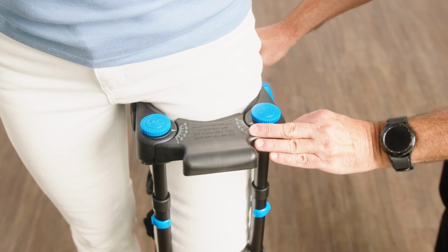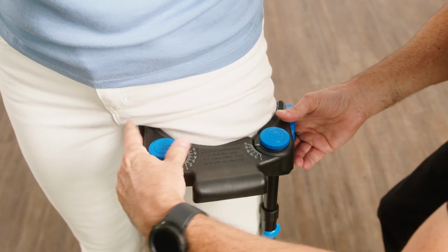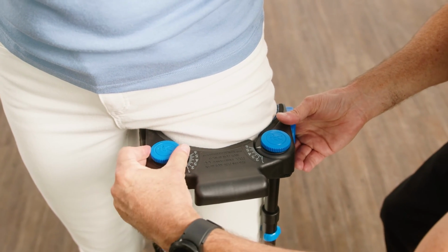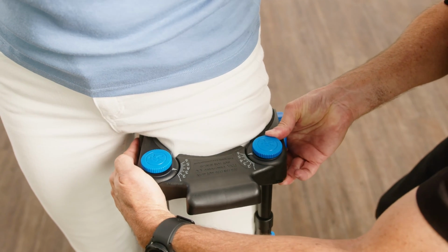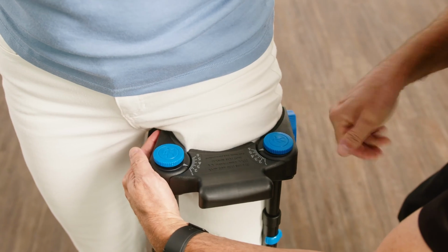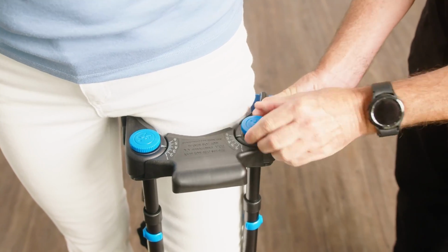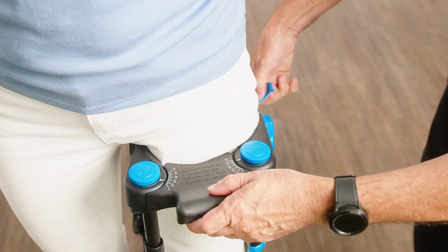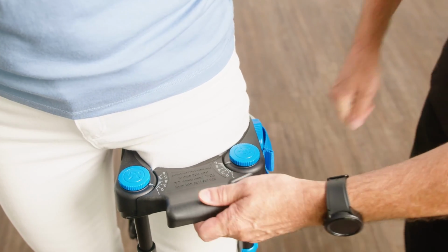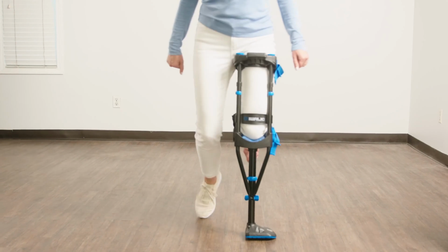Release the tension of the upper thigh strap. Note the number settings of the thigh supports. Loosen the thumb screw of the inner thigh support and decrease the number setting by 1 or more. Then retighten the thumb screw. Repeat the process for the outer thigh support, but this time increase the setting by 1 or more. Then retension the strap. Repeat adjustments to the thigh supports until the crutch is angled correctly and the full width of the tread is in contact with the ground.